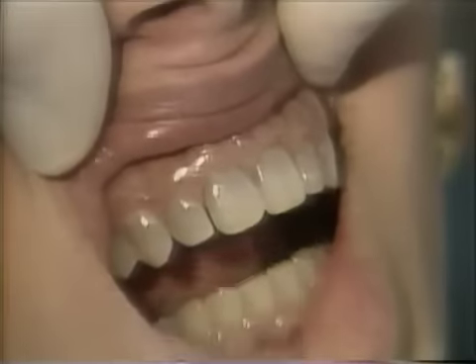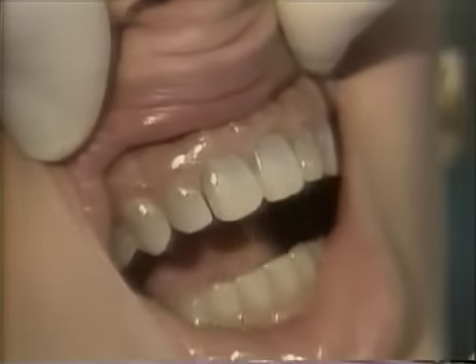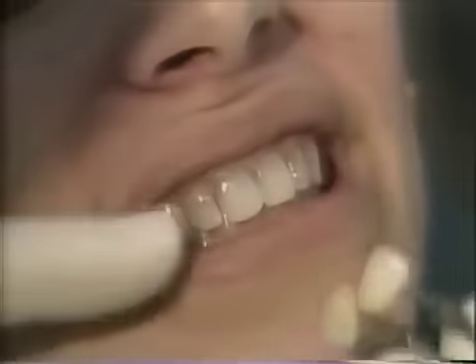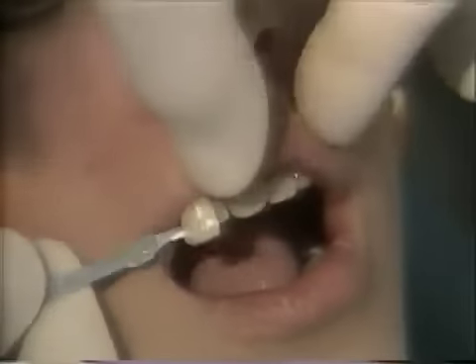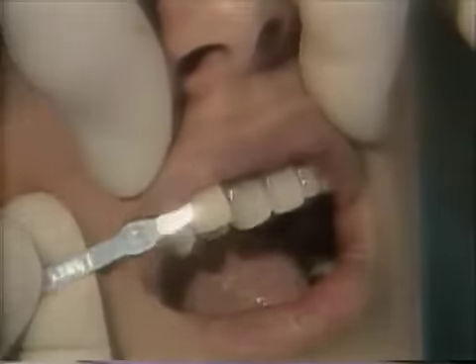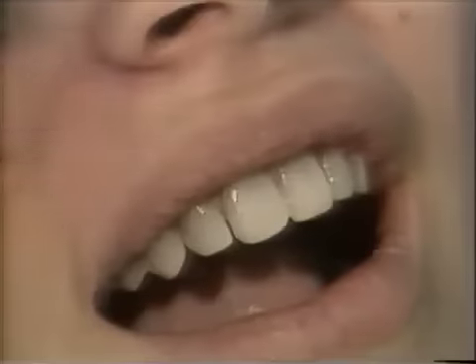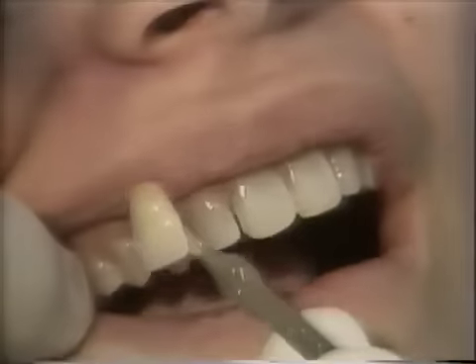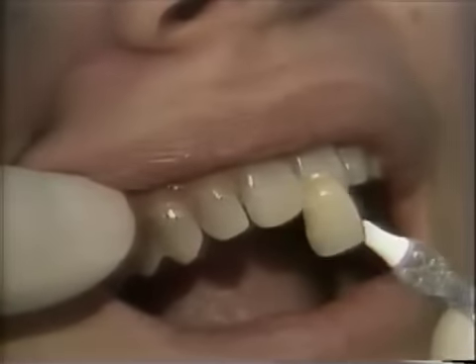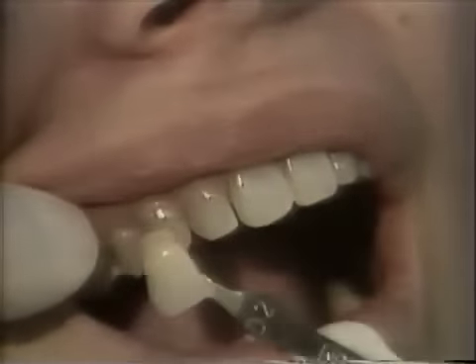It is a good idea to take a shade of the teeth beforehand. We have determined that we will be using an A1 shade for the central incisor and lateral incisor, and a D2 shade for the cuspids, which will give us a gradual transition to the darker posterior teeth. You will see when we are bonding these how we will make a gradual transition from the lighter central to the darker cuspid.